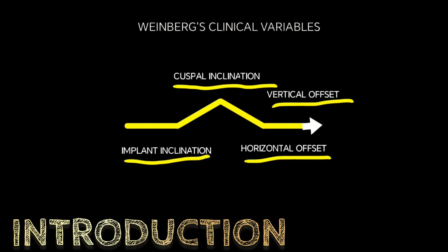A comparative evaluation of the torque at the gold screw, abutment screw, and implant was calculated for these clinical variables.